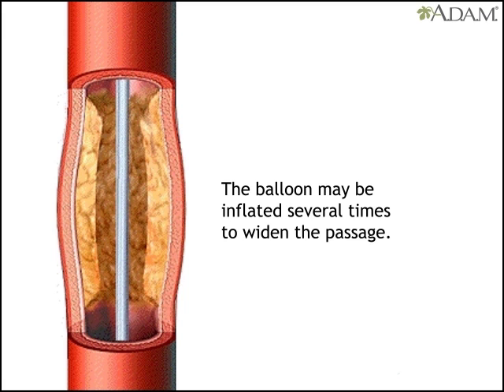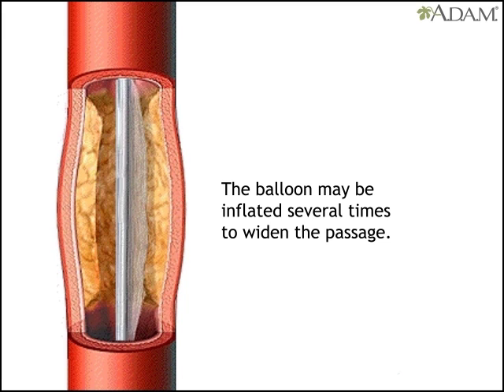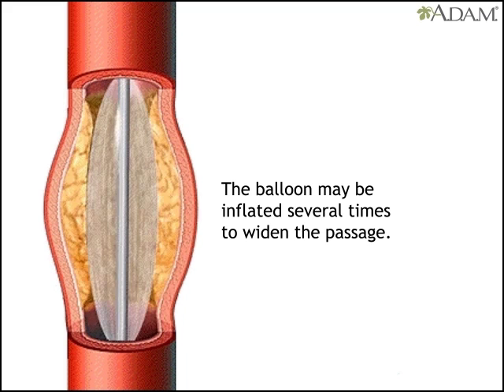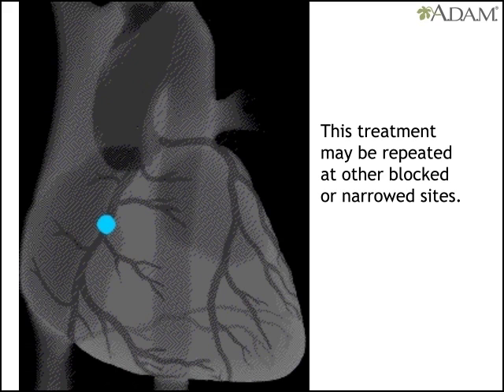Then it's deflated. The doctor may inflate the balloon a few more times, each time filling it a little more to widen the passage. This may then be repeated at each blocked or narrowed site.